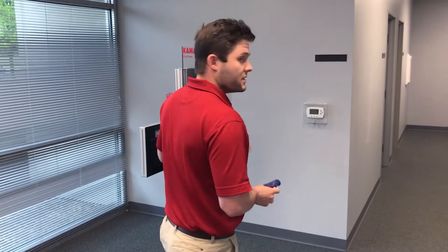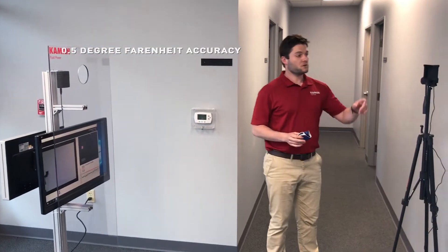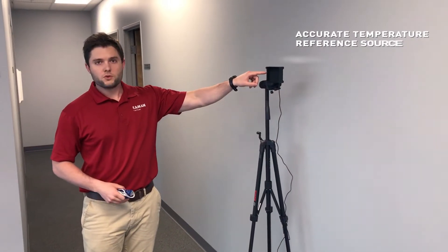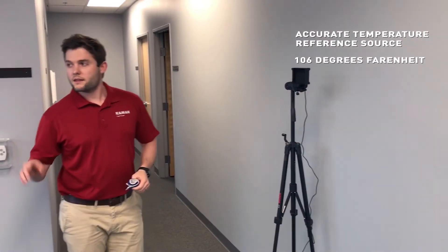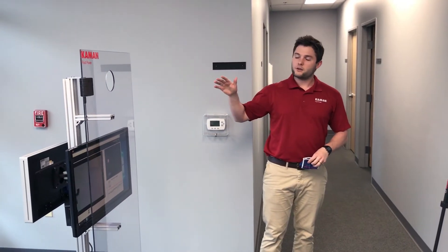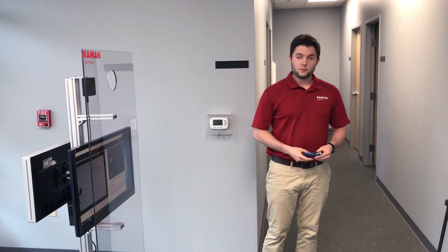This camera is able to maintain a 0.5 degree Fahrenheit accuracy, which is due mostly to what is called a black body. It provides a temperature reference source of 106 degrees Fahrenheit that the camera is constantly referencing in order to maintain accuracy and stability in different environments such as varying temperature and humidity.